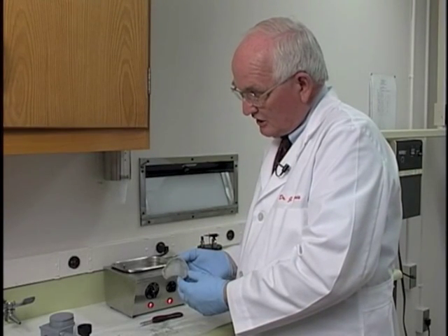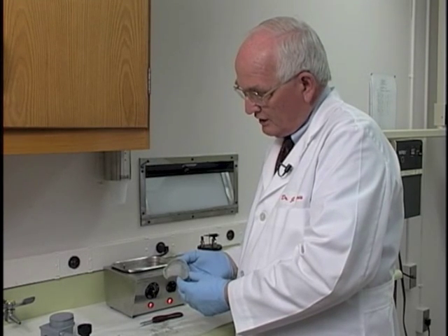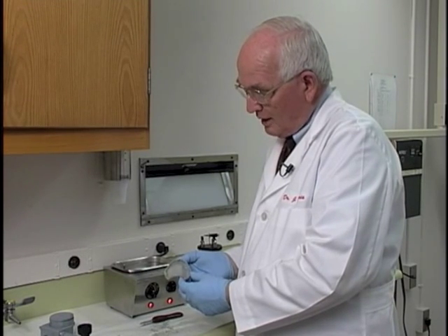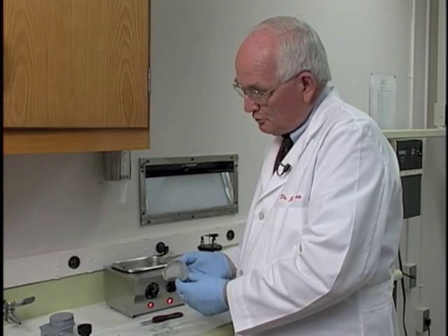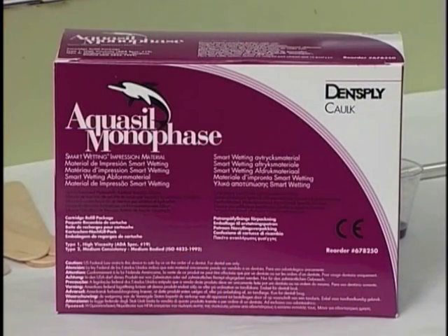Now that we've trimmed the excess material from inside of the tray, we need to rinse the tray, get rid of any extraneous material, the little chips in it, dry it, and paint it with the proper adhesive to be used for our final impression material. The material that we're going to be using to make our master impression is a polyvinyl siloxane material. Its brand name is Aquasil Monophase, and it's produced by Dentsply Company.